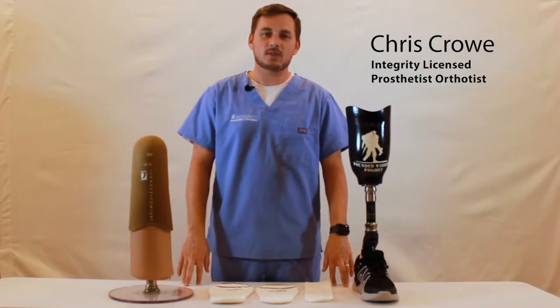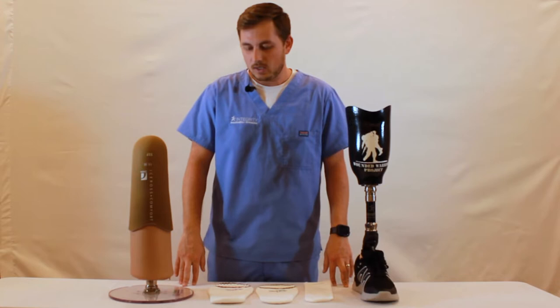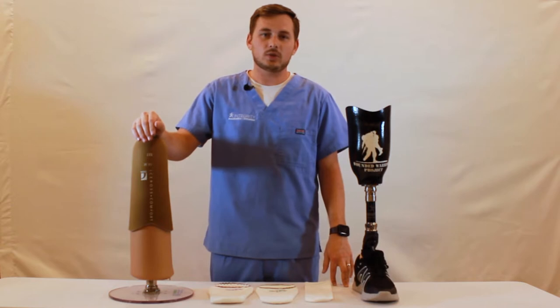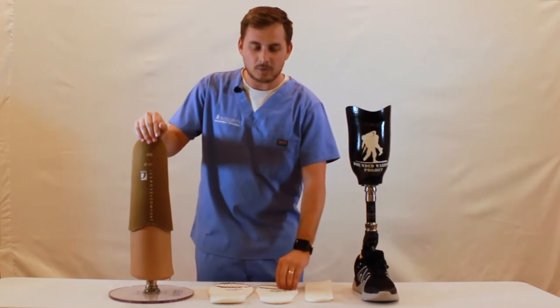My name is Chris. I'm a prosthetist here at Integrity Prosthetics and Orthotics, and today we're going to be discussing sock management. It's very common for patients to reduce in volume or fluctuate in volume with the prosthesis, and the way that we can accommodate those volume fluctuations is by adding socks.